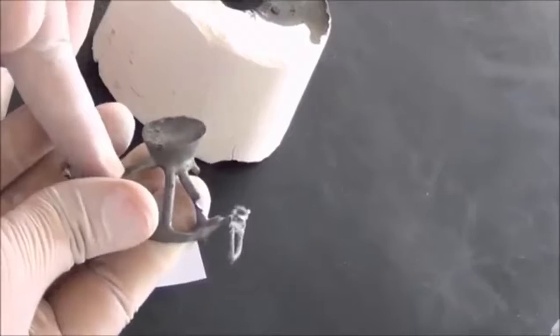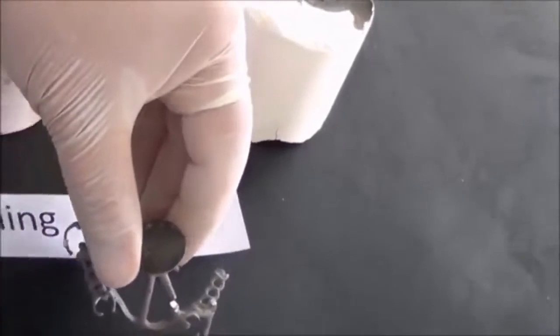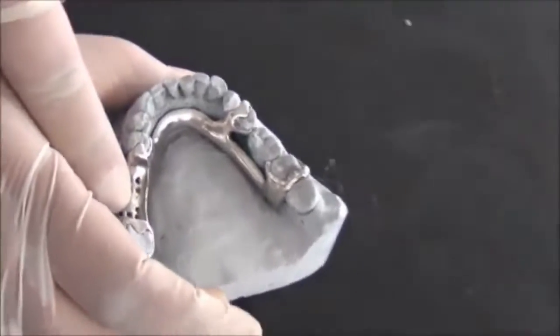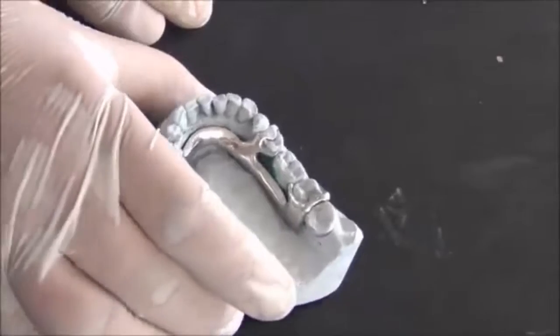We begin by cutting with specific discs. After cutting, we begin finishing them until they become totally smooth. And the metal is polished. This metal framework is now ready to go to the clinic.